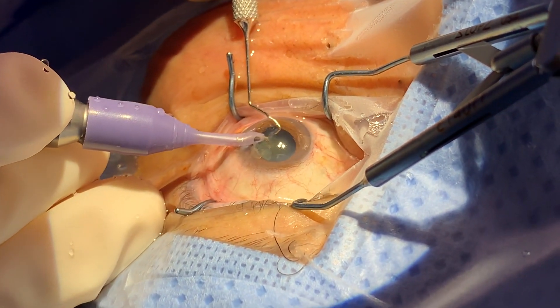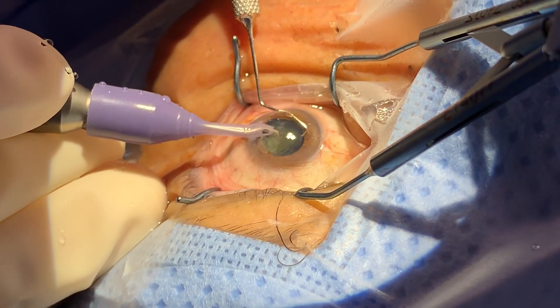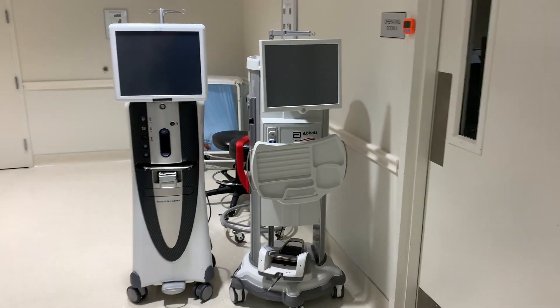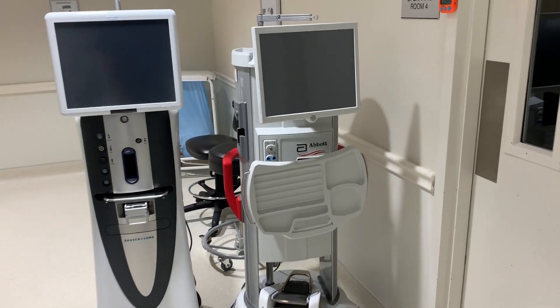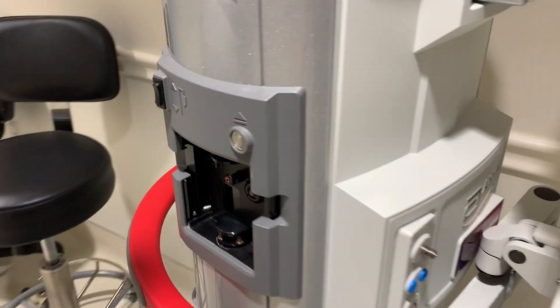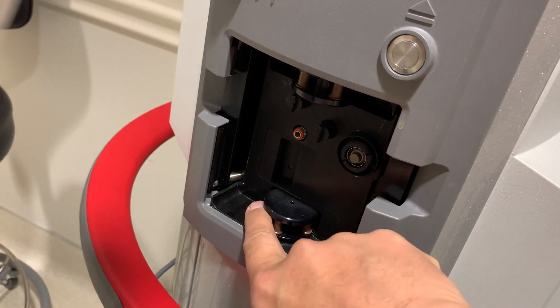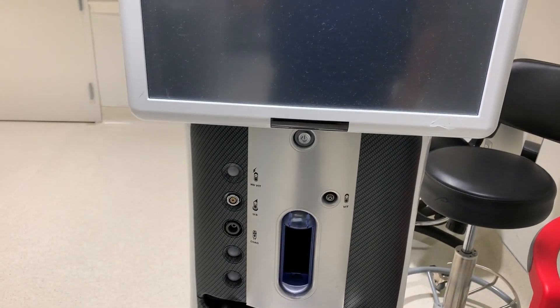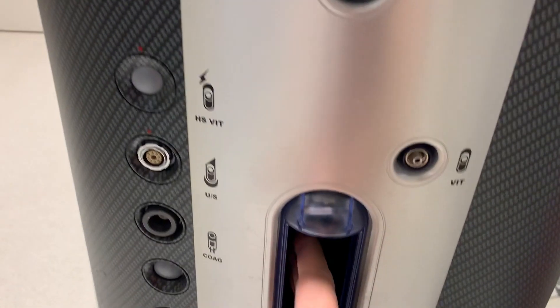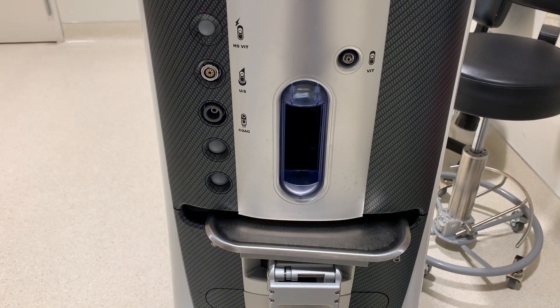When everything works perfectly within the tiny space of the anterior segment, we have very stable fluidics. Here are two FACO machines — they look very similar, but they are actually different. This FACO machine has a typical peristaltic pump, and there's another peristaltic pump here. But this machine over here is a Venturi. A cartridge goes in there, and that's going to work on the Venturi principle.